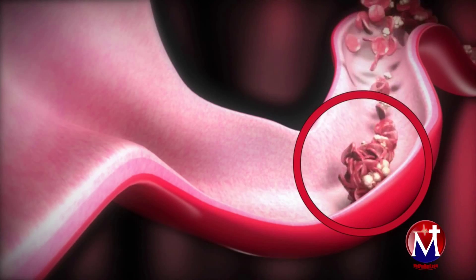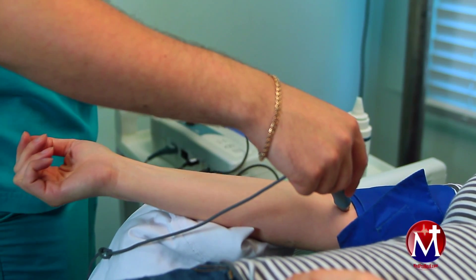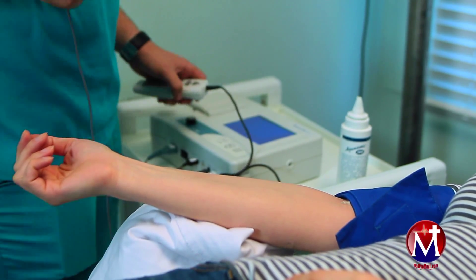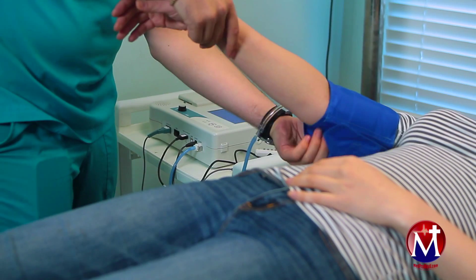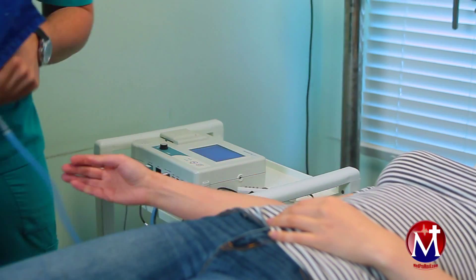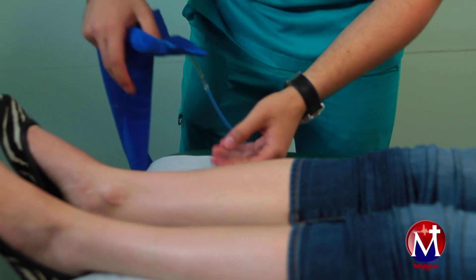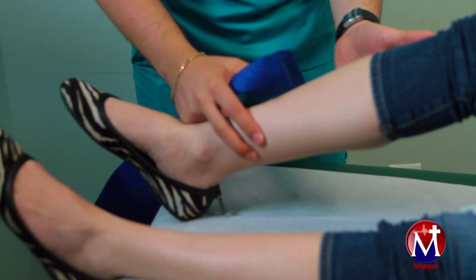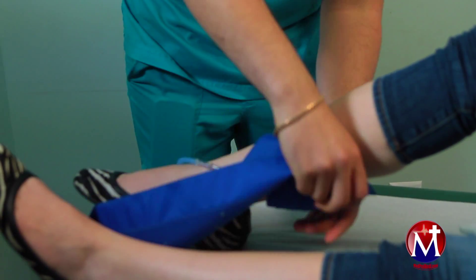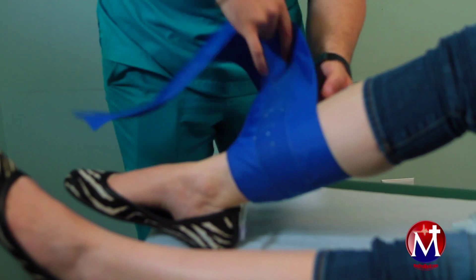Eugene right now is getting the evaluation of the upper arm. He will then place the cuff and Doppler device over the patient's right leg. The same procedure is then done over the patient's left arm and left leg.